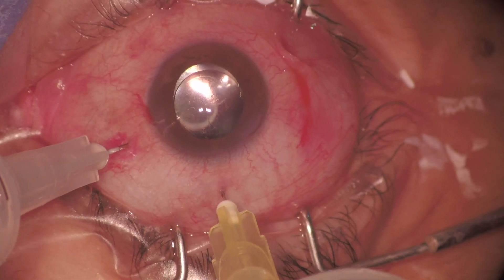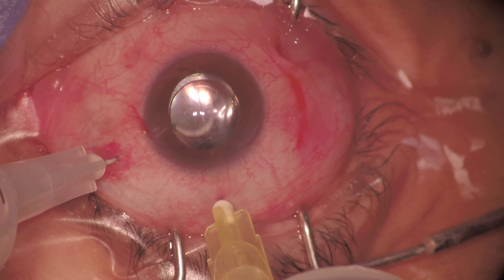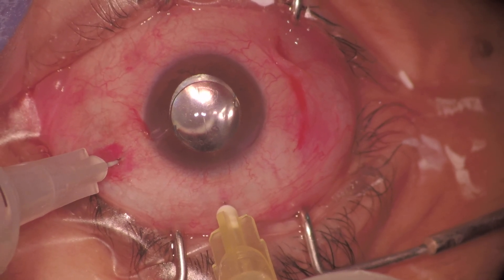If the surgeon performs the fluid-air exchange with the probe on the temporal side, it may become difficult to reposition the ILM flap over the hole by the end of the case. Additionally, the fluid-air exchange should be performed slowly and with low vacuum. This minimizes the risk of dislodging the flap from the margin of the hole and having it float freely in the vitreous cavity.